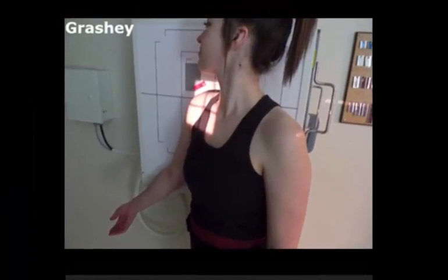Here, we have positioned the patient for the Grashey projection. The Grashey is a common orthopedic projection to look and visualize the joint space in between the humeral head and the scapula. For this, you will want to place the central ray to enter through the glenohumeral joint. For this projection, notice the tight collimation. This is typical due to the fact that this is usually an additional projection to a shoulder series.